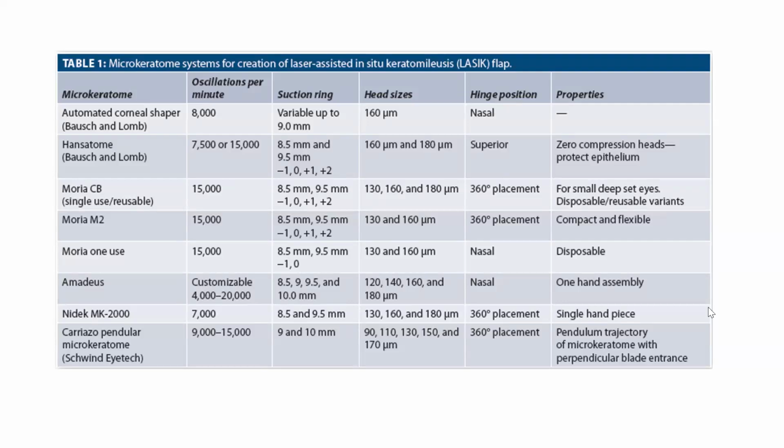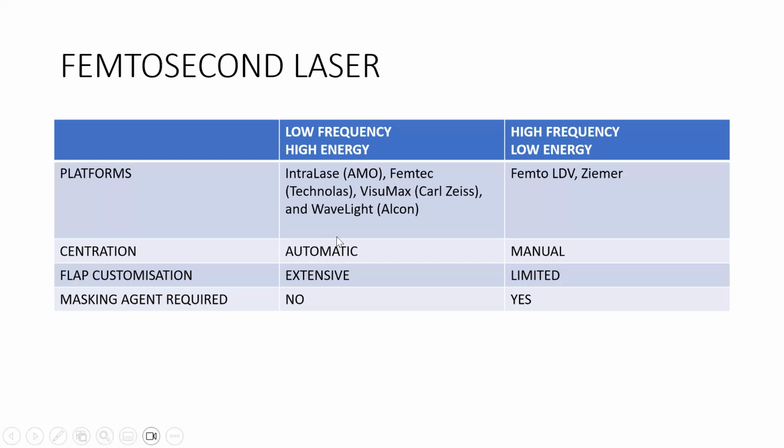Okay. Yes, sir. Let's move ahead. There's a lot of history in microkeratomes which we should ideally know about, just for the sake of knowing how refractive surgery evolved. Not that it's very relevant today, but it's good to know. So let's go ahead.